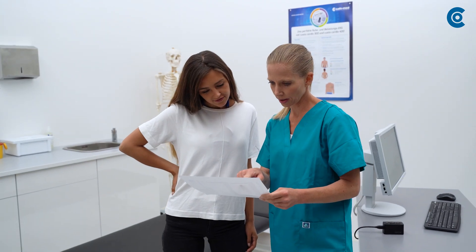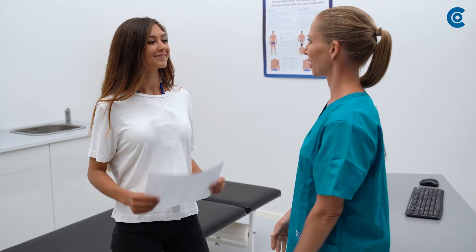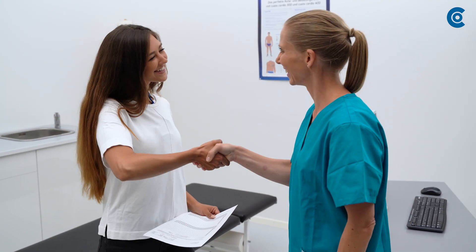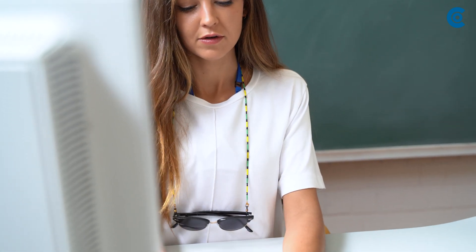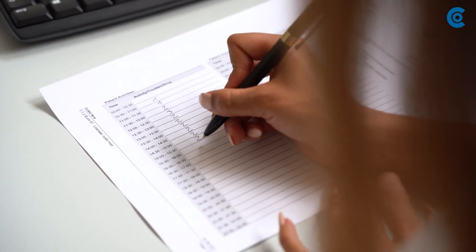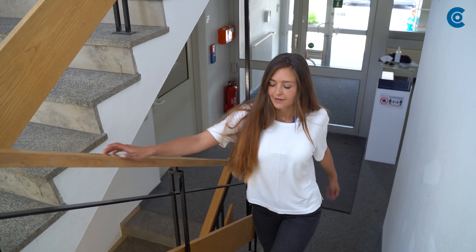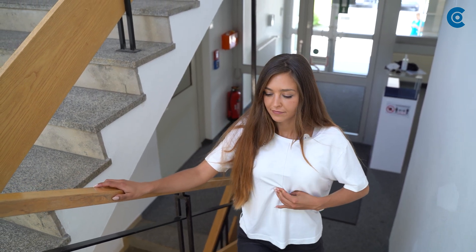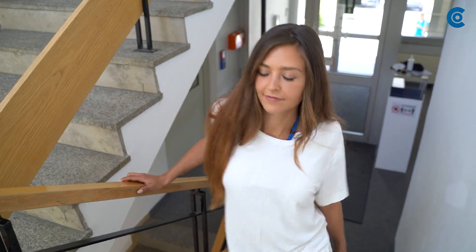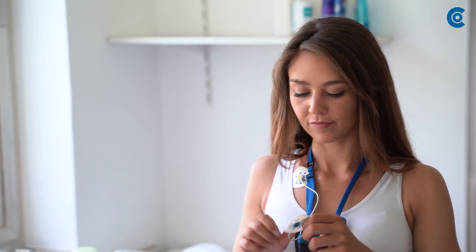Explain the patient diary to the patient and hand it over for taking home. In the next one to seven days, the patient goes about daily life and keeps records about it in the patient diary. The patient can mark abnormalities such as dizziness or discomfort by pushing the button. If the measurement takes longer than 24 hours, the patient can change the electrodes themselves to take a shower.